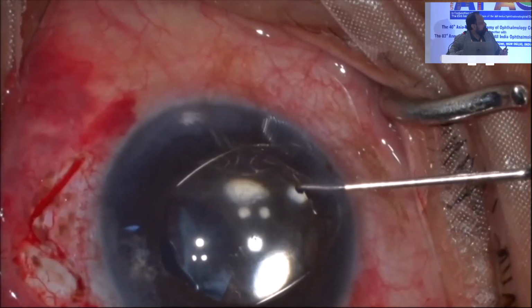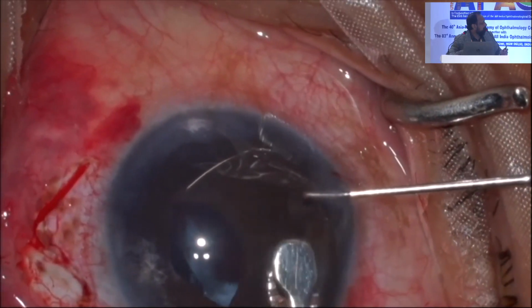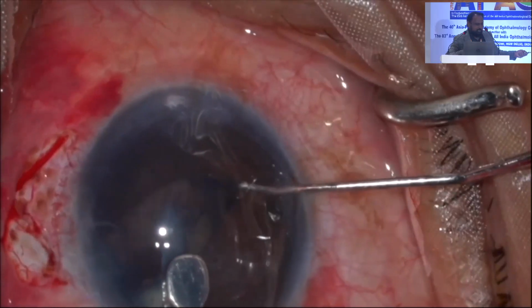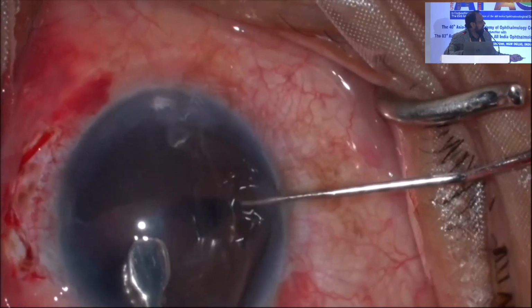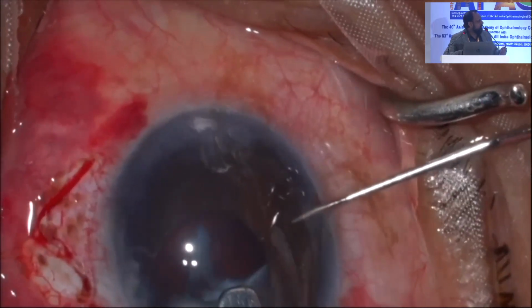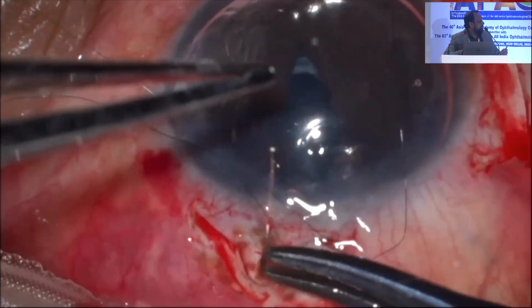So what I do is, once you hold the lens here, use your second instrument to guide the lens under the iris just by stretching the iris, because I have seen a lot of instances where people try to just push the lens down below the iris, and that can cause damage to the iris and bleeding. So just use your second instrument, guide it, then go inside and clip it.